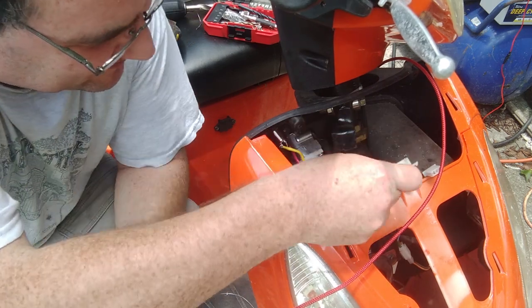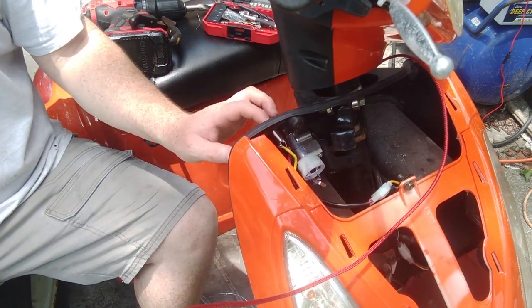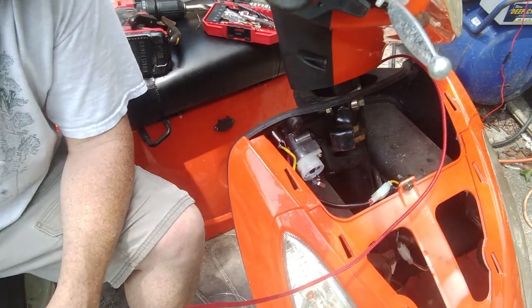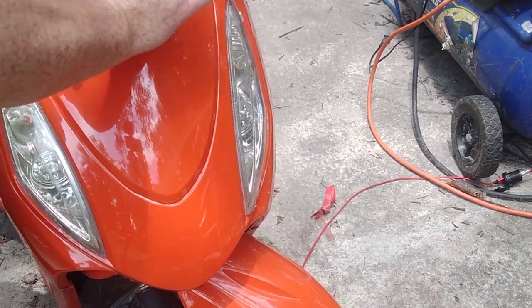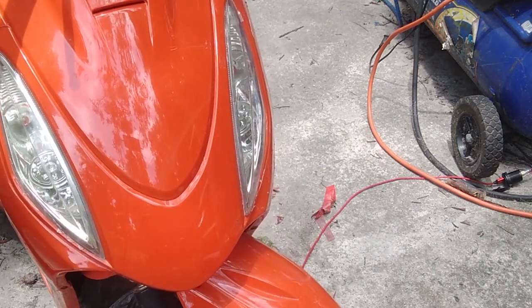Now I can plug that back in. There we go — that was easy enough. I'm going to put the front cover back on and call that good. Just like that, it's back together.